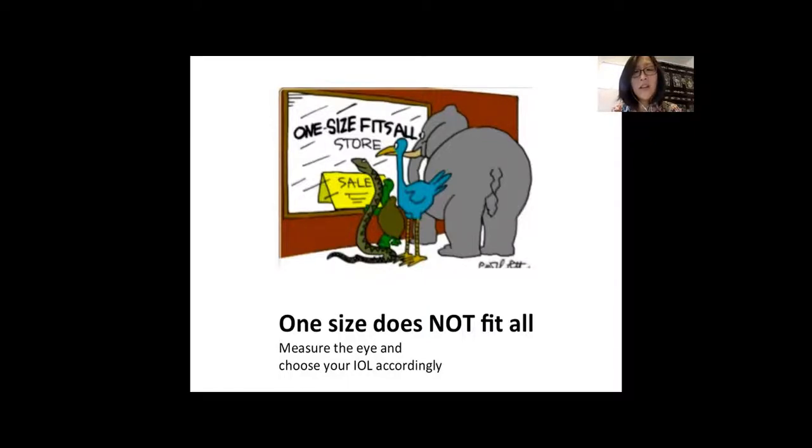What I feel that that does is it gives us a range of vision, so a patient is able to walk around without glasses, look out at distance, but then I tell them with a mild monovision, with a -1, they'll be able to look at their watch, they might be able to pick up a newspaper, they'll be able to go to a grocery store, pick up things off the shelves without the need for reading glasses. And so this, I think, in the right patient is a good option. I would say that 70% of patients will tolerate this. About 25%, 30% will not tolerate that difference, even a very mild difference of a -1.